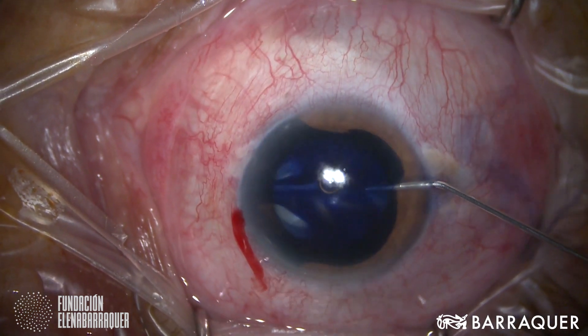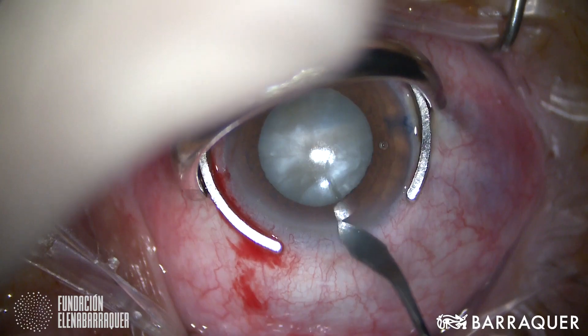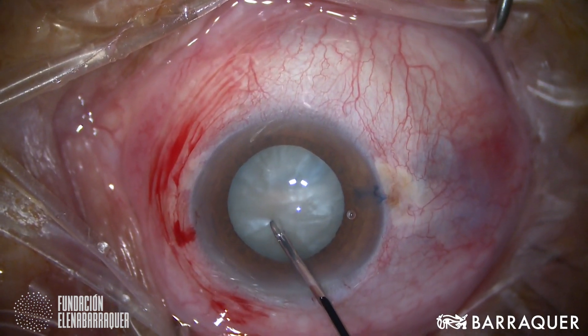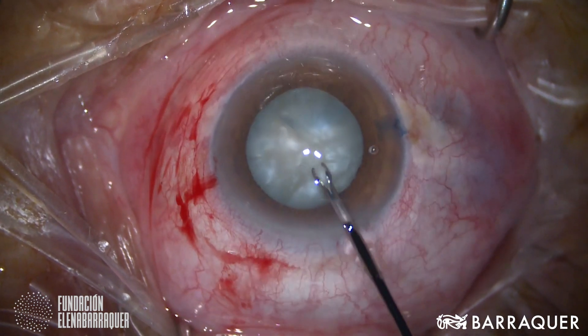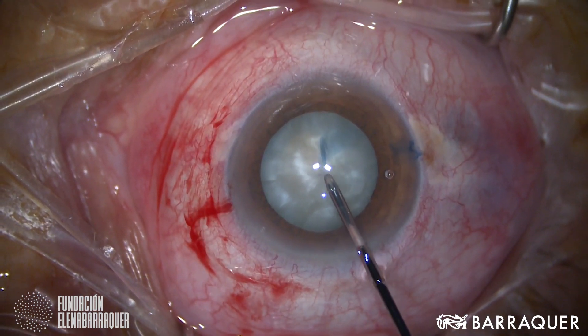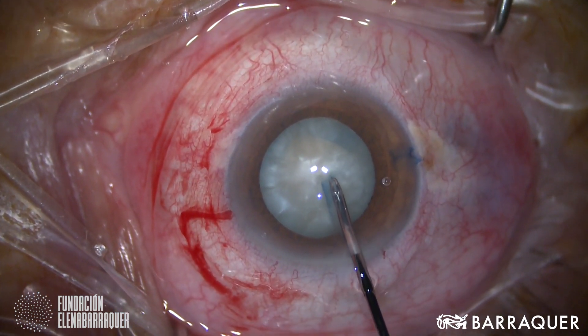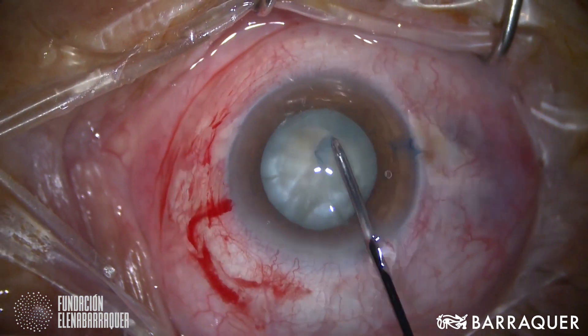And now I'm going to show you a few examples on how and when to utilize Vision Blue. The first case shows a regular mature cataract. I'm injecting Vision Blue in the anterior chamber to stain the anterior capsule, then washing it with balanced salt solution. Sometimes I inject viscoelastic material directly, but in this case I prefer to wash it, and then I'm performing a capsulorexis, which with the stain was no trouble at all.